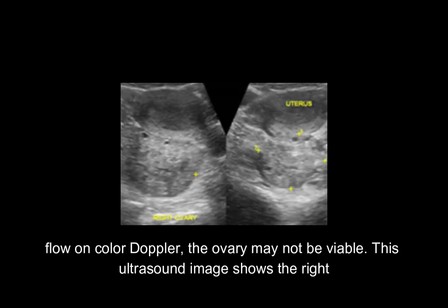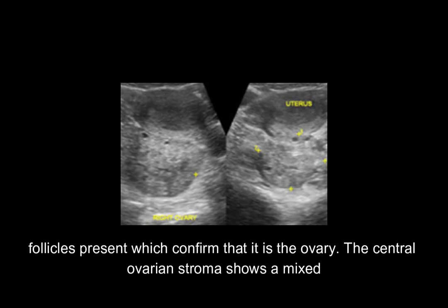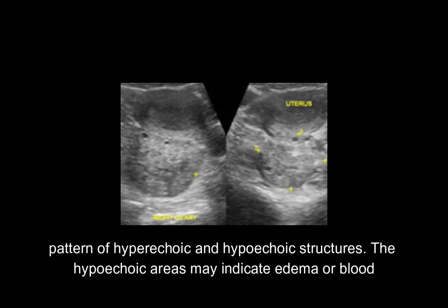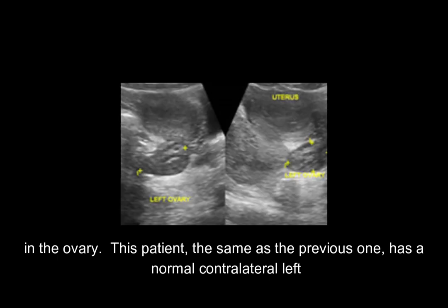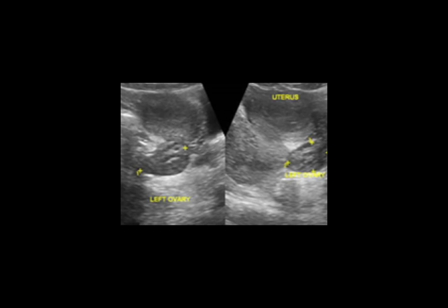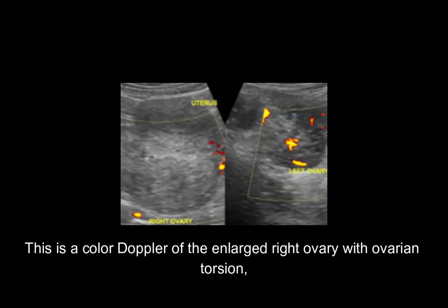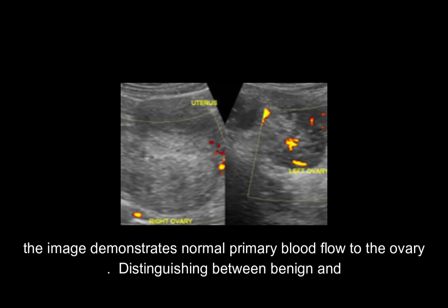This ultrasound image shows the right ovary of a patient with ovarian torsion. The ovary appears enlarged, with peripheral follicles present confirming it is the ovary. The central ovarian stroma shows a mixed pattern of hyperechoic and hypoechoic structures. The hypoechoic areas may indicate edema or blood in the ovary. The same patient's normal contralateral left ovary shows expected size and standard architecture with ovarian follicles. A color Doppler of the enlarged right ovary shows only peripheral blood flow and no central flow, while the normal left ovary demonstrates normal primary blood flow.